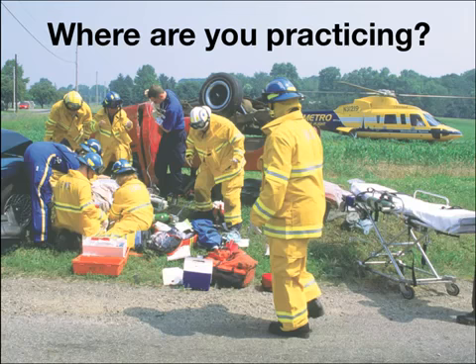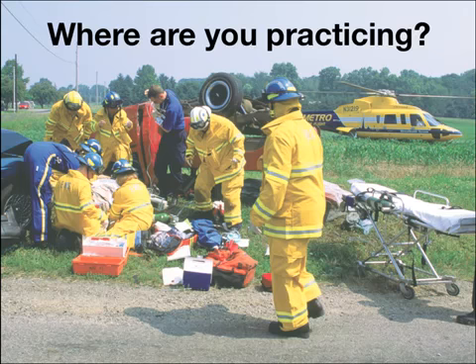When performing the eFAST exam, it's important to look at your practice environment. Somebody who would be practicing in this environment that had no OR availability or immediate accessibility to other imaging modalities could potentially perform the eFAST exam a little bit differently than somebody working in a fully equipped trauma center with immediate availability to the operating room.